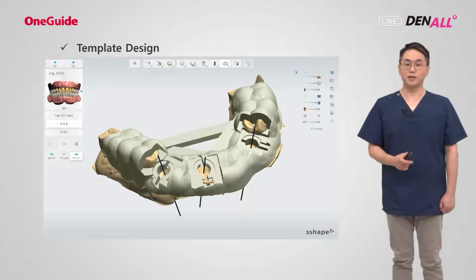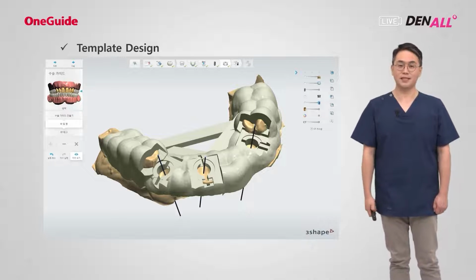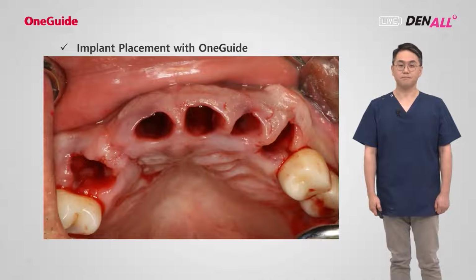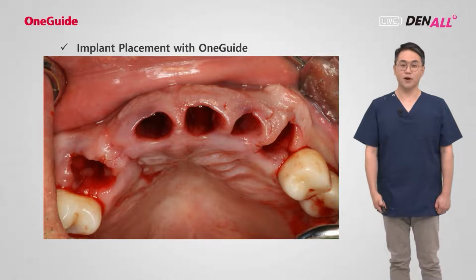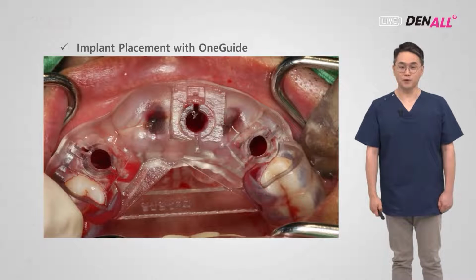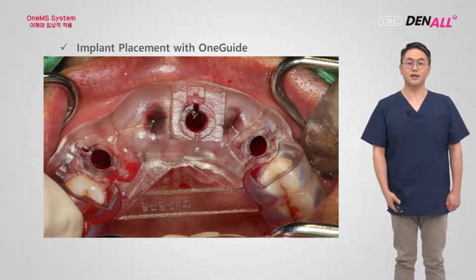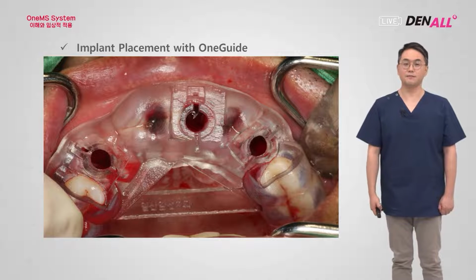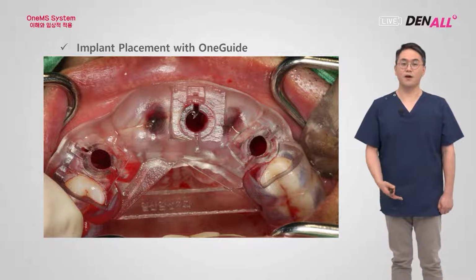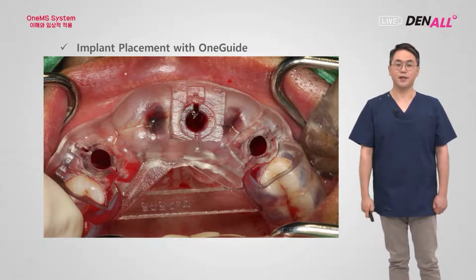And the OneGuide template was designed for adequate and accurate drilling and procedures. And after extraction on the day of surgery, the template was delivered, and then we saw whether there is a gap between the teeth and the template, and if it fit well. And if it fit well, then you go for drilling based on the diameters that you planned.